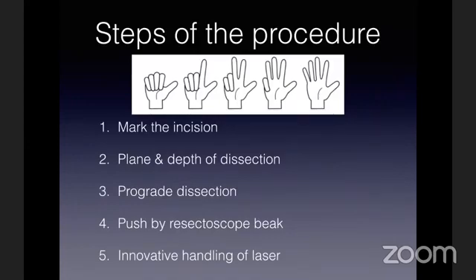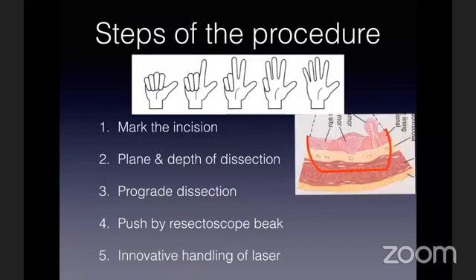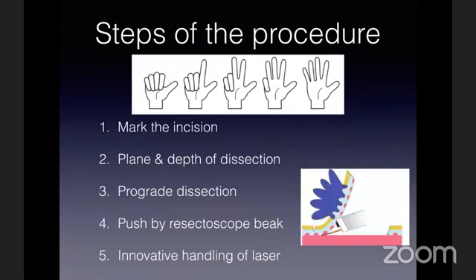After doing a thorough cystoscopy, identify the tumor and mark the incision well. Once you mark the incision, you also decide your depth of excision — the depth of resection should go through the superficial detrusor muscles. Once you have entered below the tumor, remain below it using the resectoscope and go from one marking to the other. For a tumor at a favorable site, you would start at 6 o'clock and gradually go towards 12 o'clock, trying to elevate the tumor. At difficult sites, you would innovate in handling the laser.